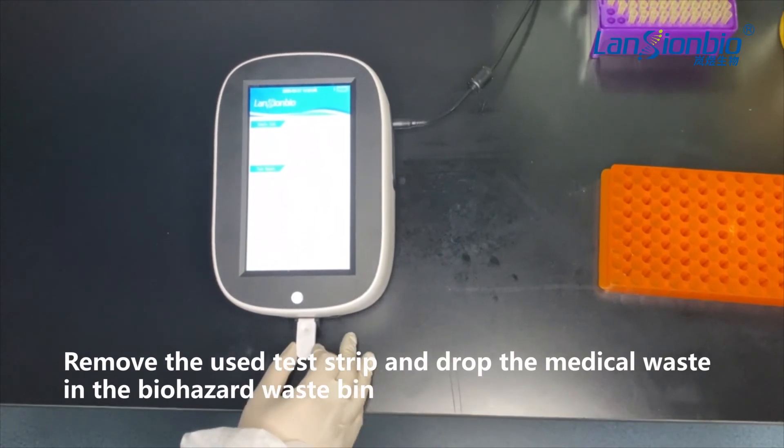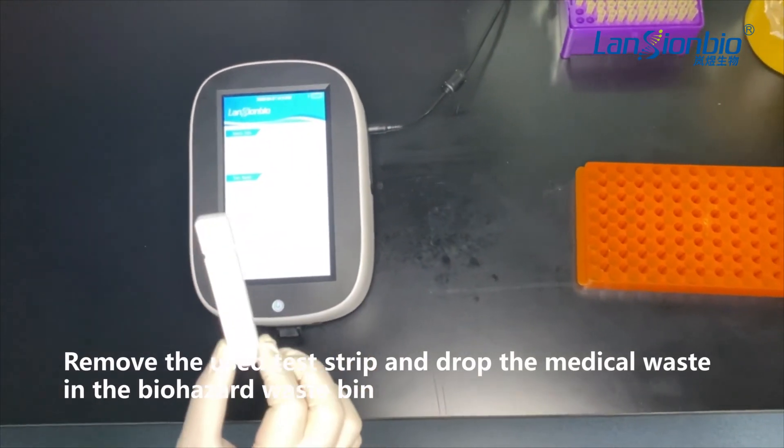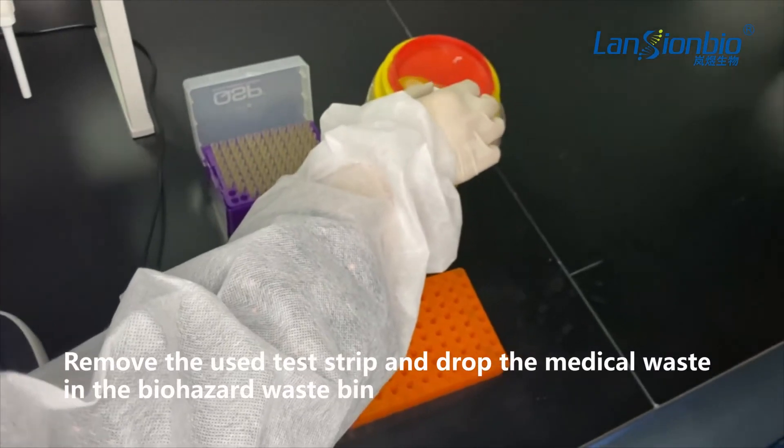After testing, remove the used test strip and drop the medical waste into the medical waste bins. Then click test.